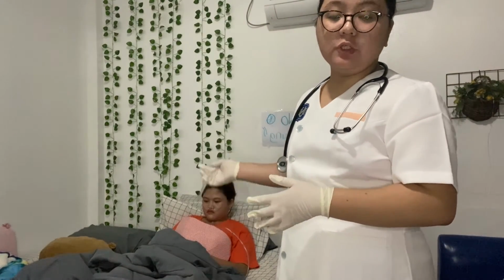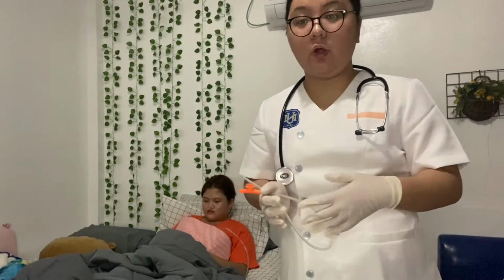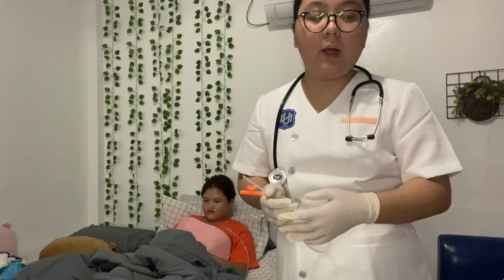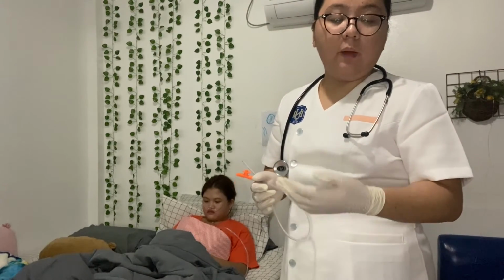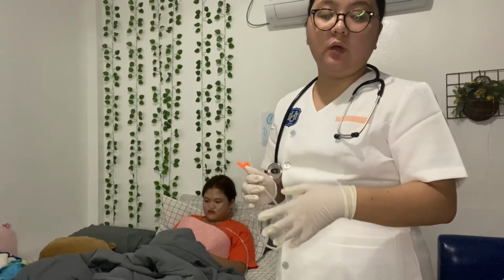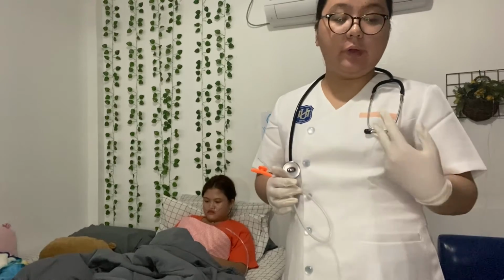So when the artificial airway and tracheobronchial tree are sufficiently cleared of secretions, perform a nasal and oropharyngeal suction. When catheter is contaminated, do not reinsert it into ET or TT.